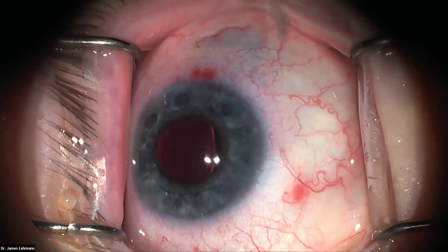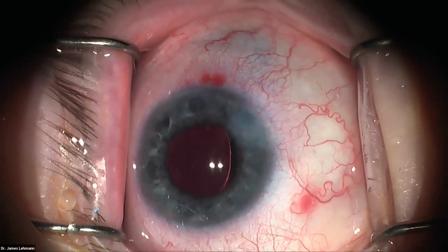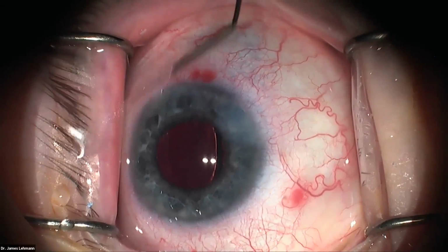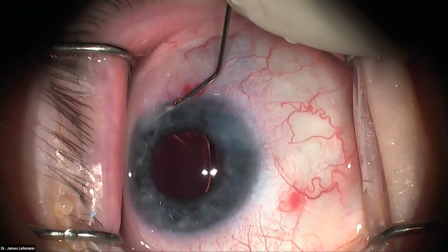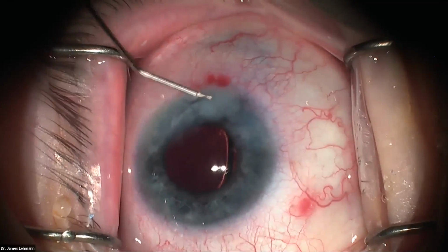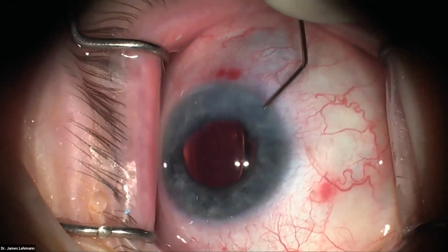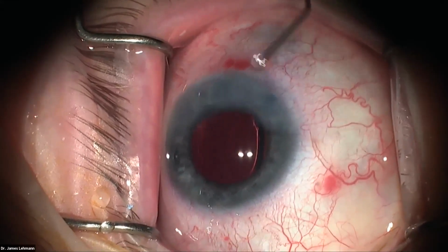And this is moxifloxacin that I'm injecting into the anterior chamber. We like to do that on all our cataract cases. And here is just hydration of our incision. You can see it whitening the stroma there. And then we're going to test the incision. The way I do that is just by injecting into the paracentesis here, seeing the chamber deepen, that's a good sign.